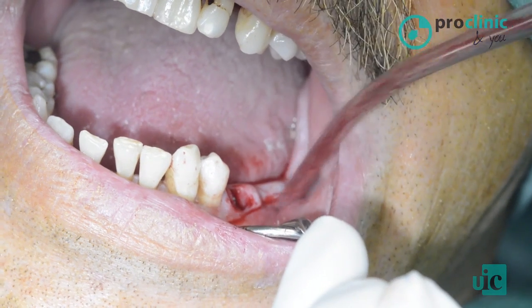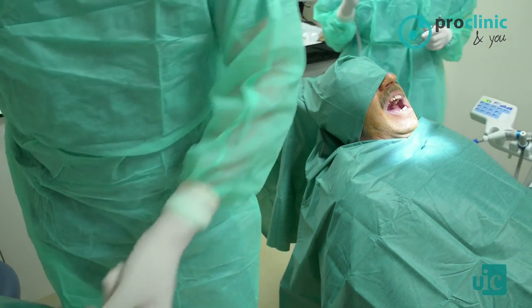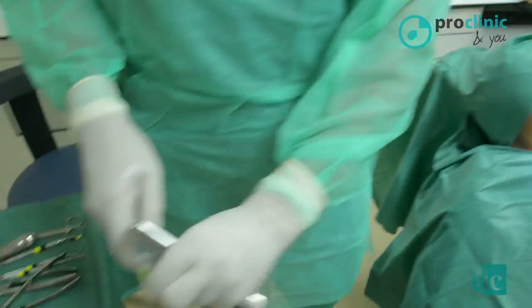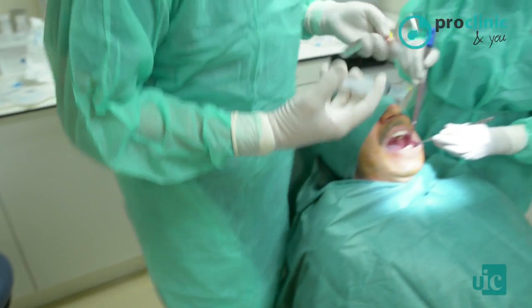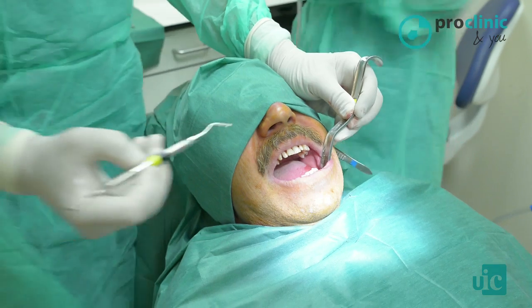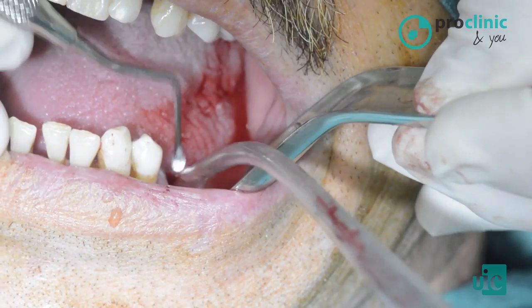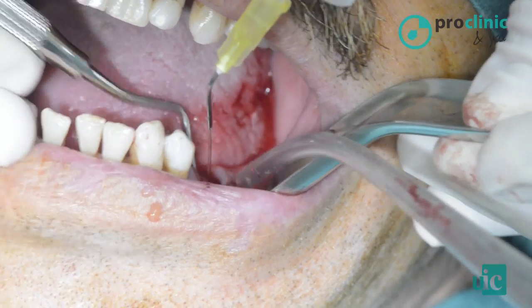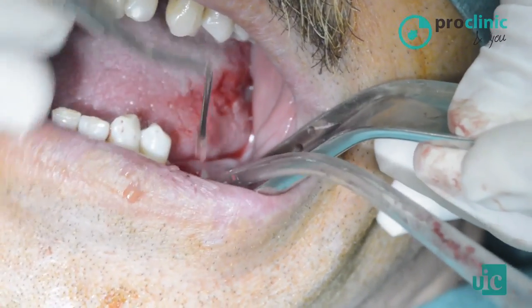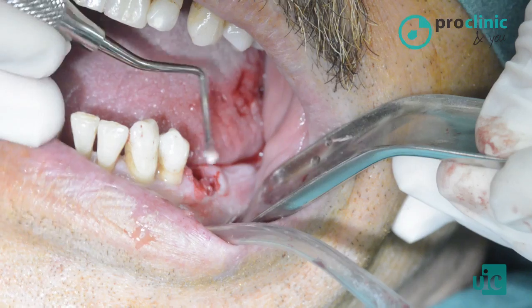Now that we have a bloody alveolus after the extraction, we should clean the alveolus of inflammatory tissue and irrigate with a saline solution. A profuse wash with saline. First we wash. We use surgical curettes to remove it from the periodontal tissue because it is usually firmly attached. Okay? So we keep removing this inflammatory tissue of the periodontium. It is very attached.